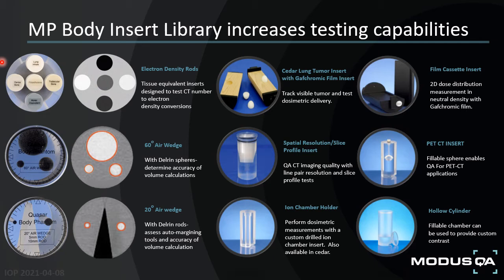And so this apparatus actually allows for the calibration of your CT scanner because even qualitatively you can quite easily discern the attenuation differences between each of the materials. But in addition to this, one can also validate the CT number value to relative electron density conversion algorithm in your treatment planning system, which is definitely needed in any CT SIM QA protocol.